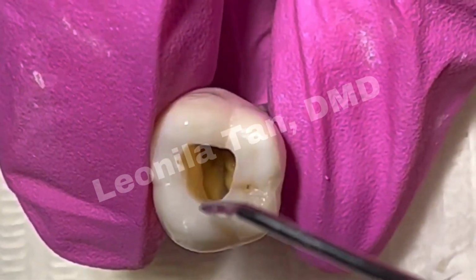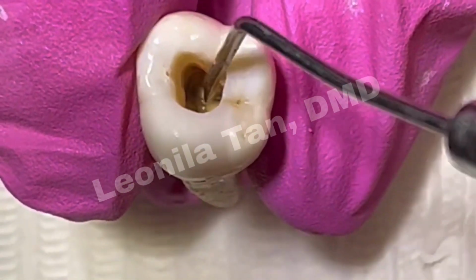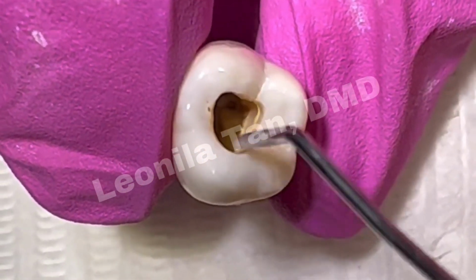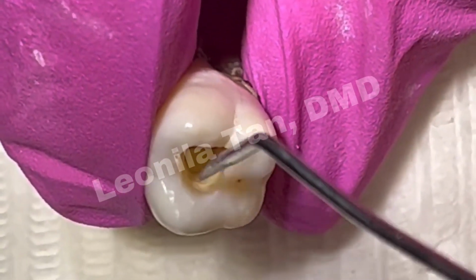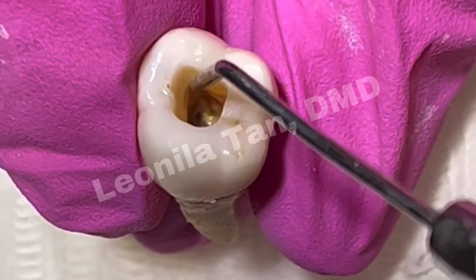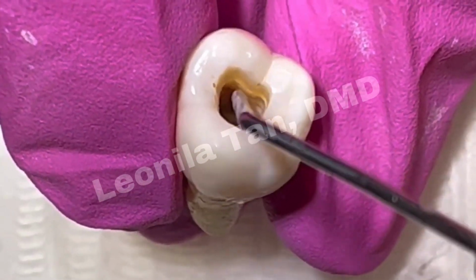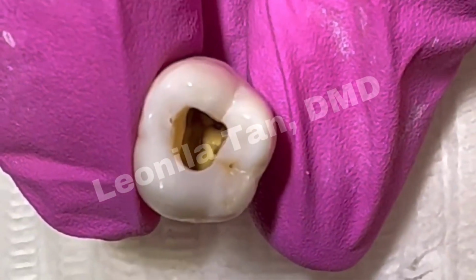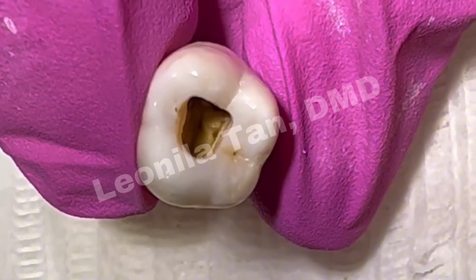That's why you should be very careful in diverging, especially your mesial and the buccal wall. The distal wall is not always diverged, but you just have to open it up. And notice that you diverge your walls until you expose or open up the pulp horns. So that's your completed access preparation for a maxillary molar. For this, it's a maxillary second molar.